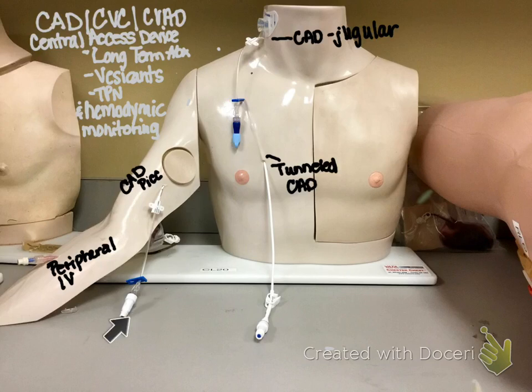And then these others are positive. This dark blue is a positive pressure cap. This one's white, positive pressure cap. So sometimes you see different caps different ways, but they all should have a cap, sometimes 2 caps on them. These should have these light blue caps, these chlorhexidine or alcohol caps, but they don't. But that's an example of one there.